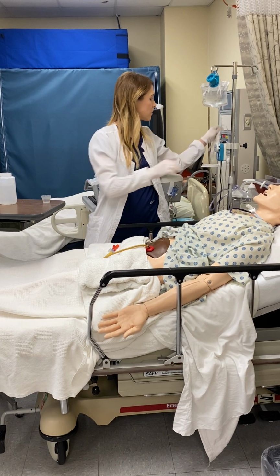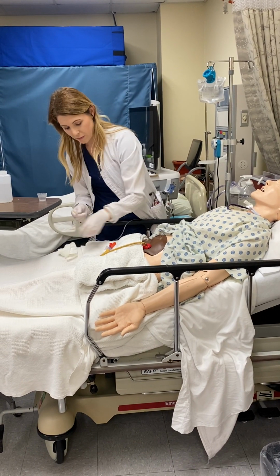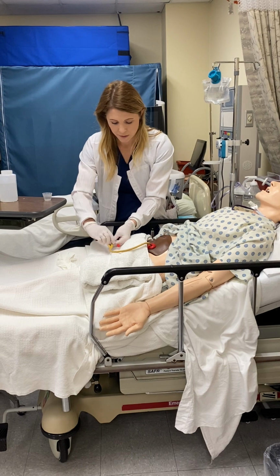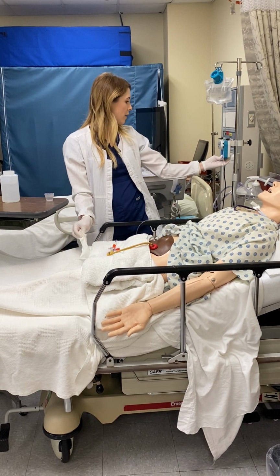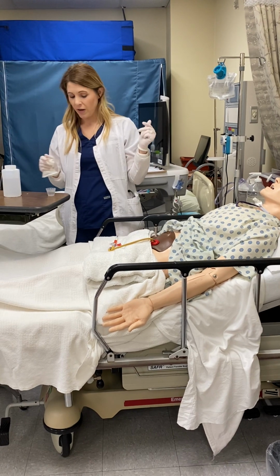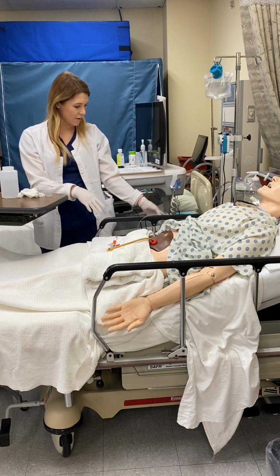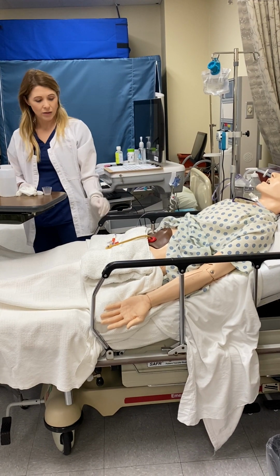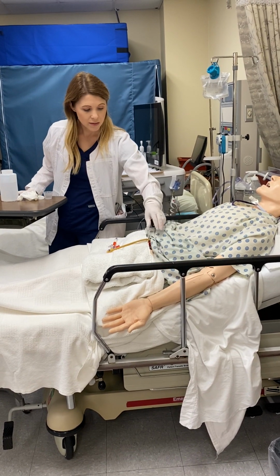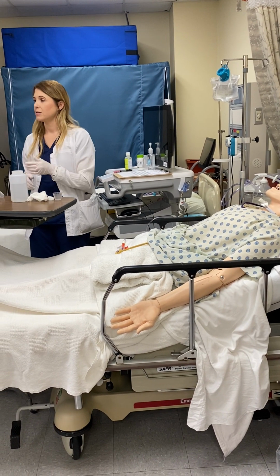So I'm going to reconnect your feeding now. Open your stopcock back up and hit run, or set it back up if it was off, and let it keep running. Making sure it runs, it doesn't alarm on me, everything's flowing freely, and it looks to be working. Alrighty, sir, that's all I have for you today. Do you need anything else? And then he's done, okay?